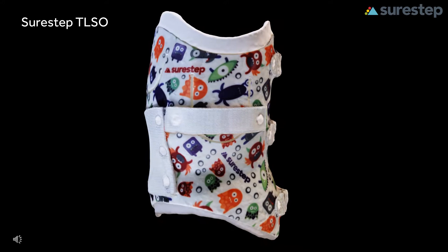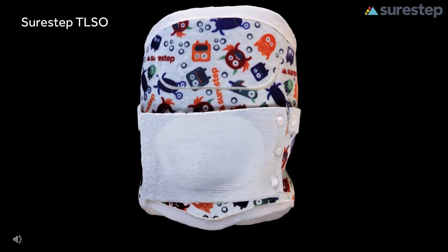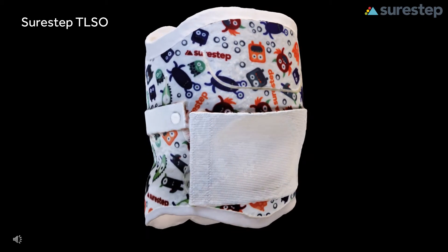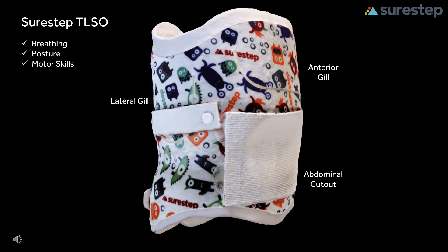It has multiple modifications that allow you to further customize it for each patient. In this example, you see a posterior opening with all three of our breathing modifications: a lateral gill for rib expansion, a belly cutout with abdominal binder that allows your patient to breathe through their diaphragm, and an anterior gill that allows anterior superior chest expansion. These breathing modifications allow your patient to breathe more efficiently in the TLSO, which then allows them to work on posture and motor skills more effectively.